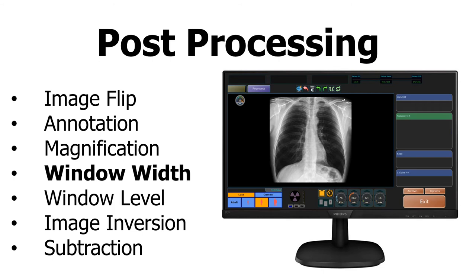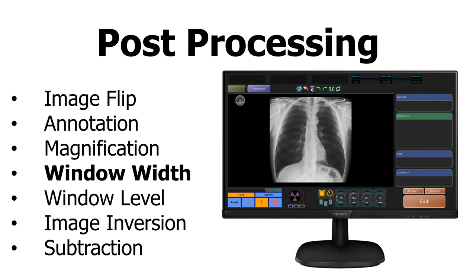Window width adjusts contrast. Usually, you can hold down the left mouse click and move the mouse side to side to increase or decrease contrast.